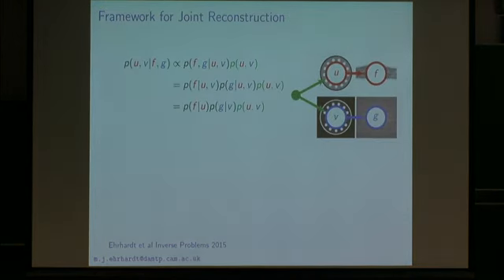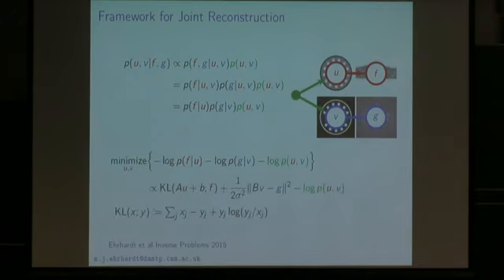And let's go over this one. So how do we do this? We start from the joint log posterior, based on a very simple graphical model that explains our intuitive beliefs on how this joint framework works. They are basically independent, but related by a common prior, so this essentially splits the joint posterior into three parts. If we now take the negative logarithm, we end up minimizing a cost functional that has the PET data term, the MR data term, and a common prior.